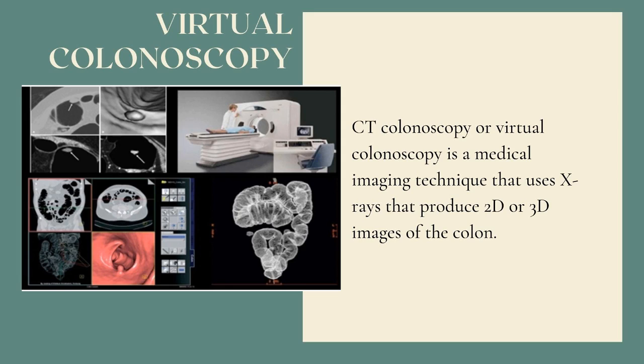Today, in our presentation, we are going to see a topic which is nothing but virtual colonoscopy. What is virtual colonoscopy? CT colonoscopy or virtual colonoscopy is a medical imaging procedure which uses X-rays and computer to produce 2 and 3 dimensional images of a colon. It includes images of the large intestine, small intestine and colon. CT colonoscopy is mainly used to evaluate colorectal polyp detection and it may be used for colorectal screening.